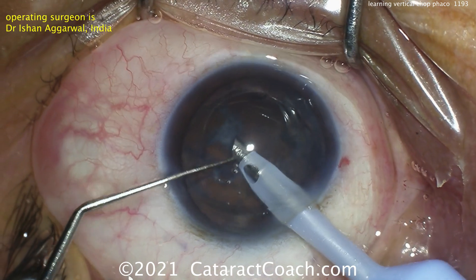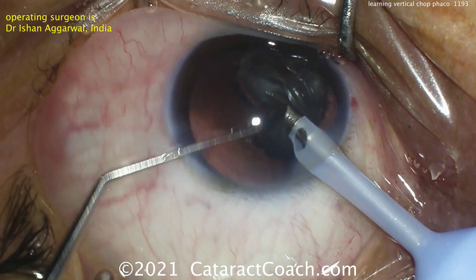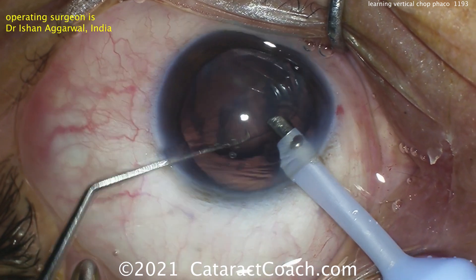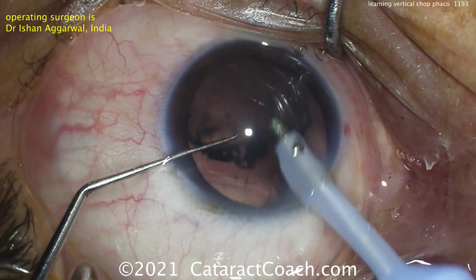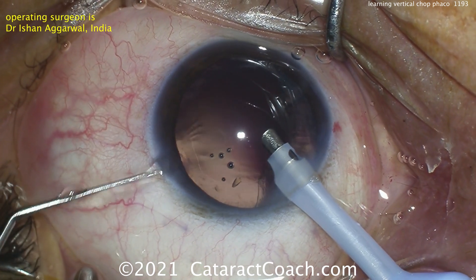A little bit of a struggle here, and this is very typical. At 700 cases, you're doing great. Remember, when I show you my learning curve, I think you really need to do at least 1,000 or 2,000 cases to really get to a good part of that mastery level. Things that happen rarely, you have to encounter them — if things happen only 1 in 1,000 cases and you've done 700 cases, chances are you probably haven't seen it yet.